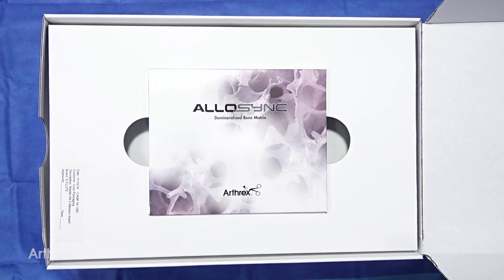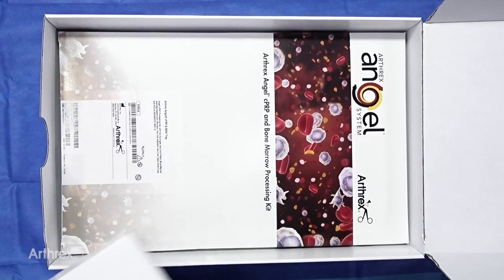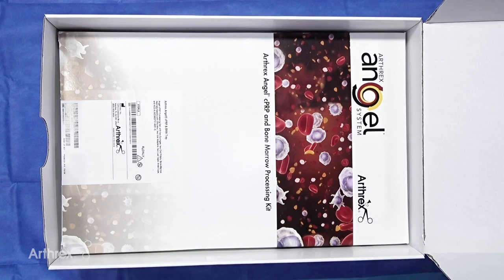As you can see here in the box as you open the BioSurge kit, this is the first thing you'll see — the Allisync matrix as it comes with this particular kit. Just beneath this you then see the Angel CPRP system that is deep to that, which is provided with this system.